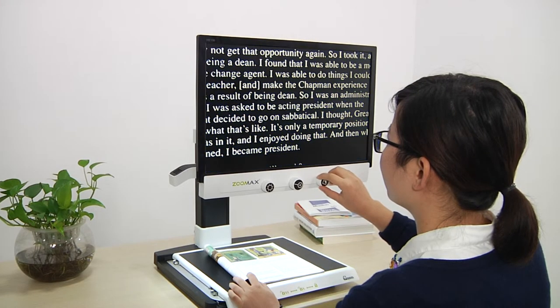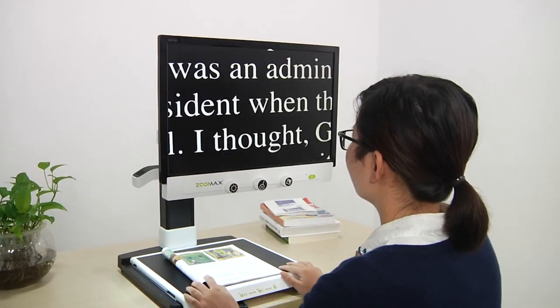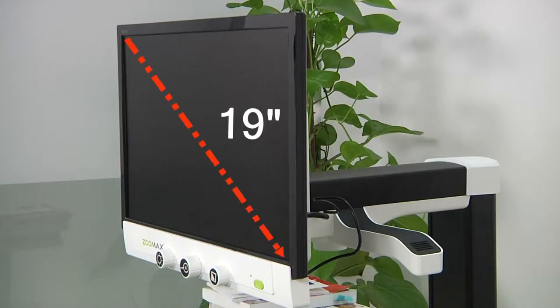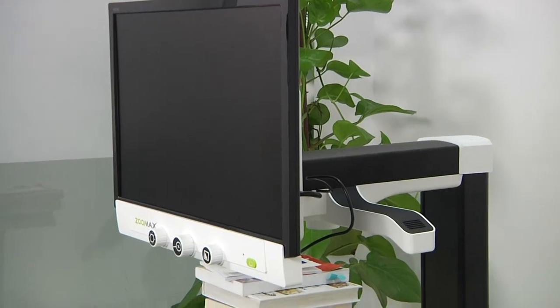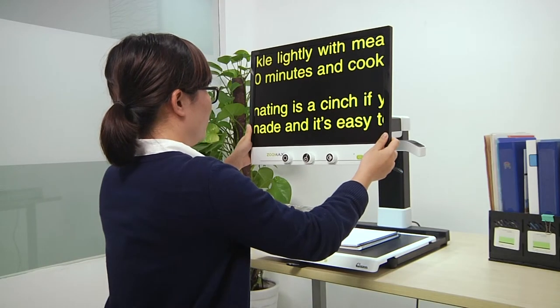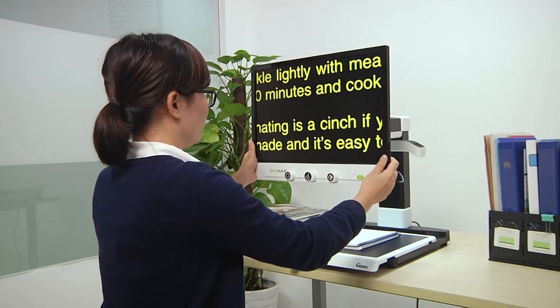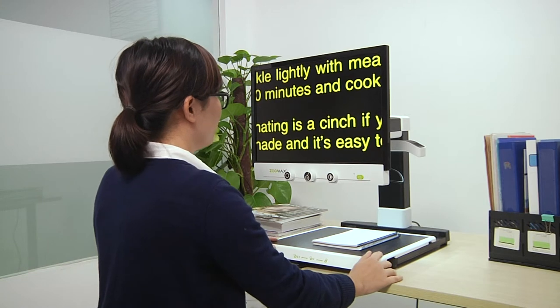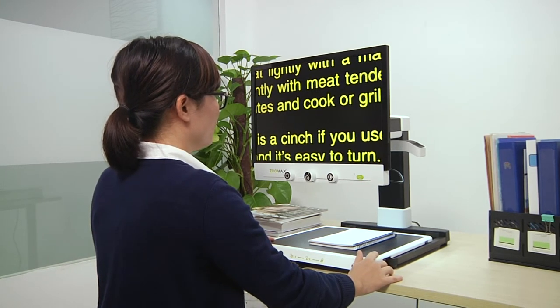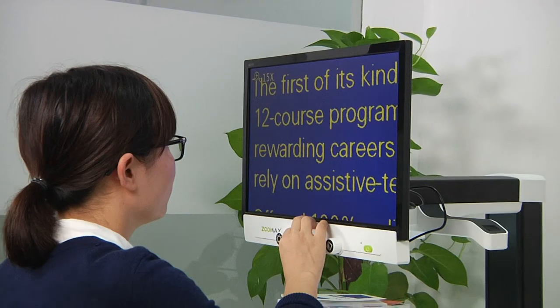Zoomax Panda is the easiest to use desktop video magnifier for users to start reading directly. Installed with a movable 19-inch screen and 19.5-inch XY table, Panda is designed to offer clear and full page reading while occupying less space. It's perfect for apartment and office. You can use it to do what you want — reading, writing, and viewing.